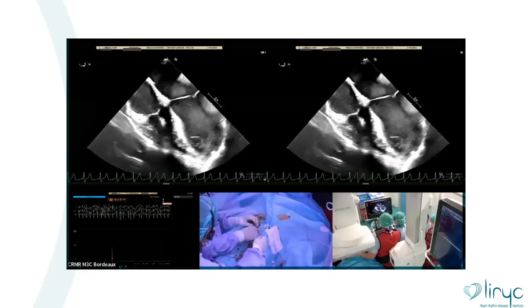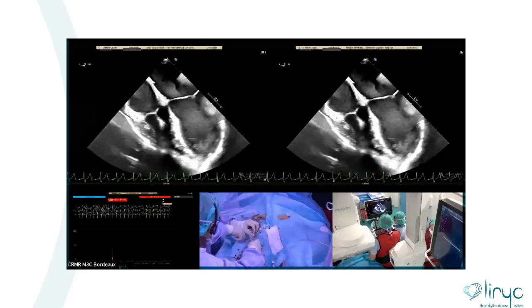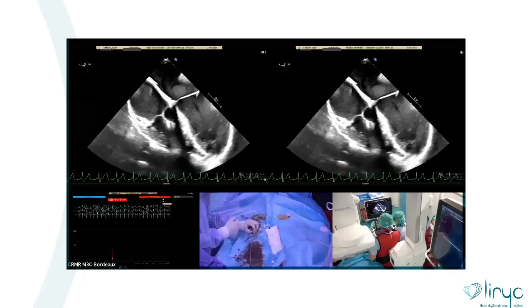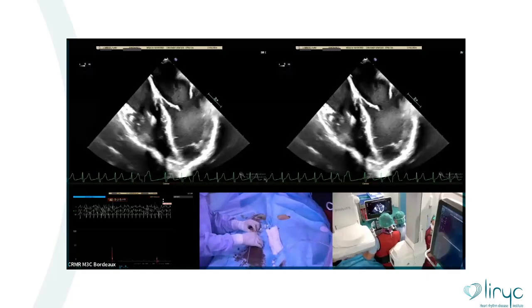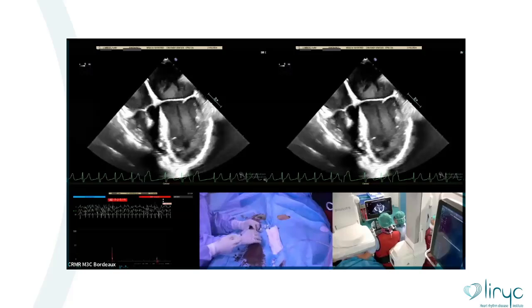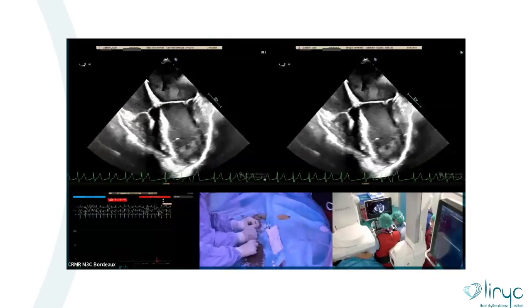Okay. So we're gonna pull back the dilator, wait a minute, and let the wire. We're going to make contrast. Hold the wire. Be careful. I will catch the wire. So Olivier, we're gonna inject.